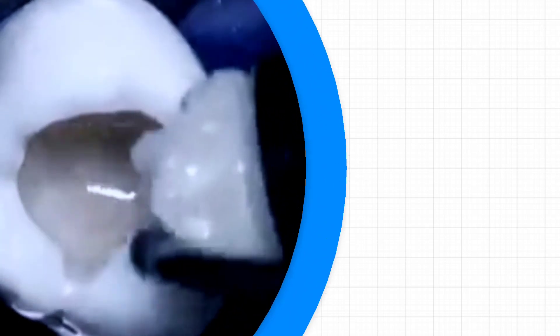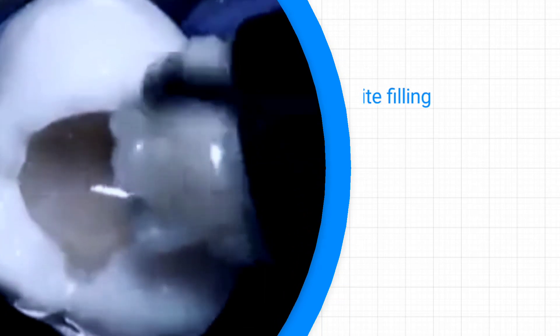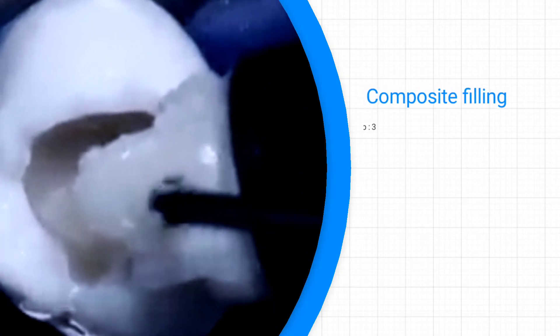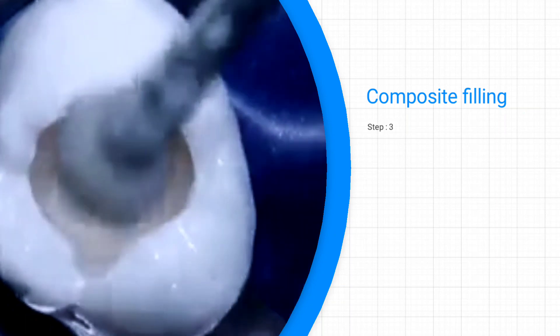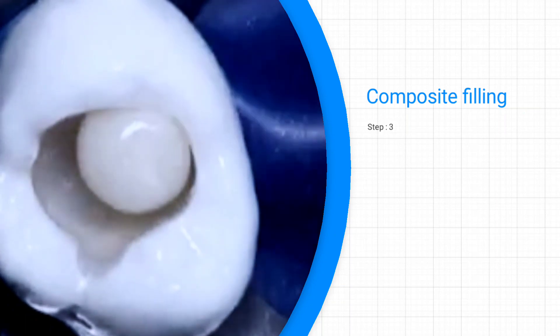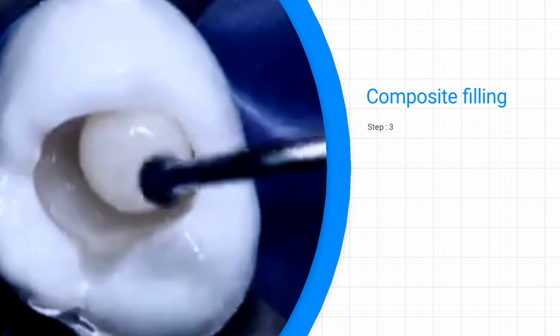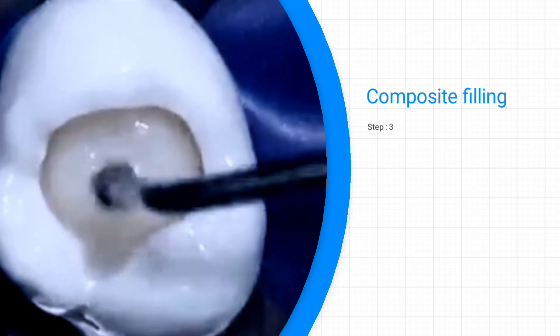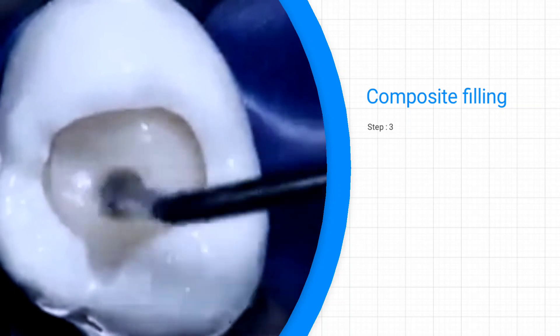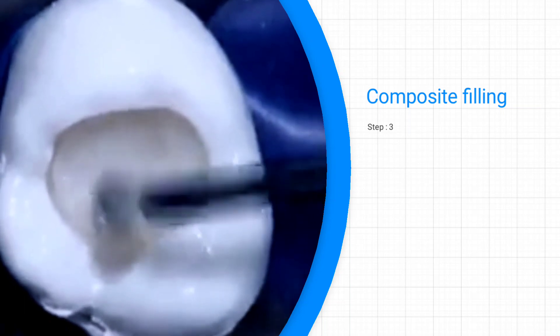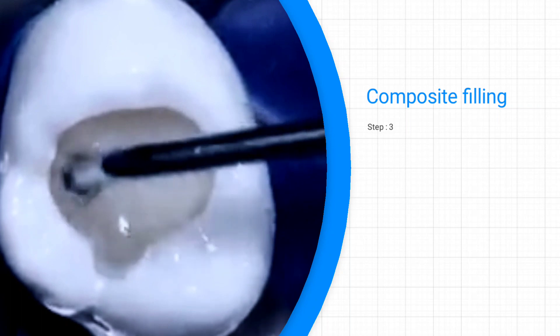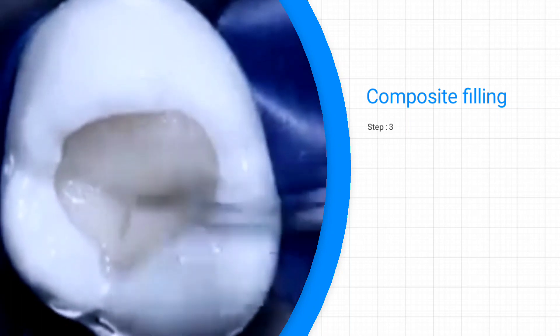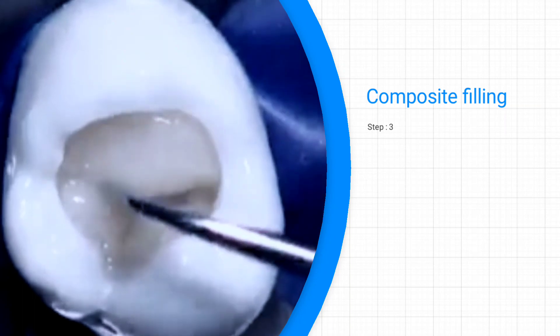Next step is to apply the composite filling, but before that, you use a shade guide to select the shade that matches the patient's tooth. Work on the composite filling that is closest to the color of the patient's natural teeth. If necessary, select a different shade for the outer surface and the inner surface, and this will make the restoration look more natural.